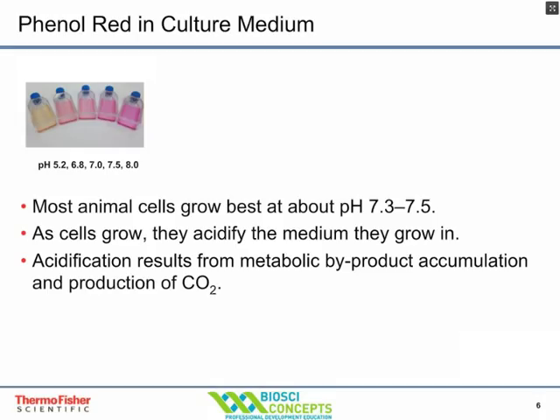The color of media with phenol red will change according to pH. We see a yellow color when the pH becomes acidic — below seven. We see a purplish color when pH is alkaline, and a nice red color when cells are growing at around neutral pH. The pH does change as cells grow because they produce CO2 and lactic acid through anaerobic metabolism, which acidifies the media.